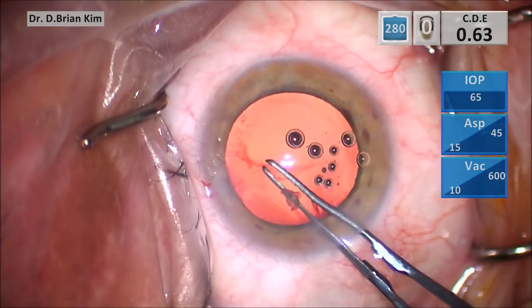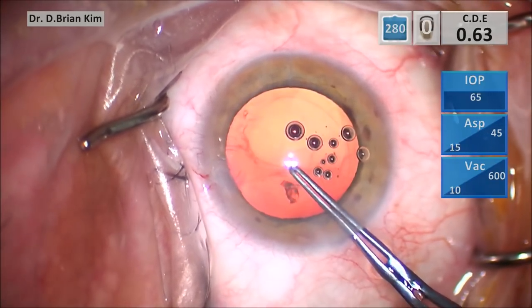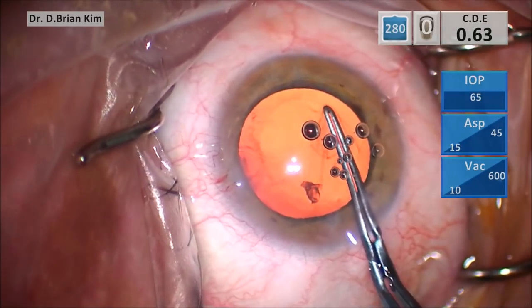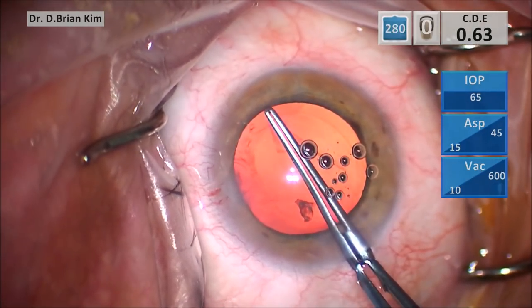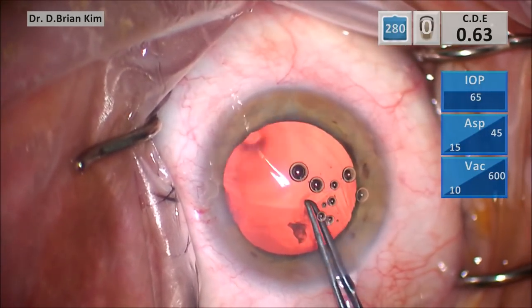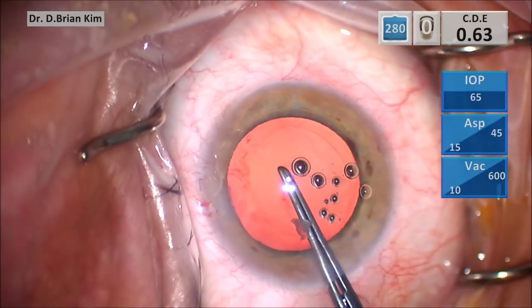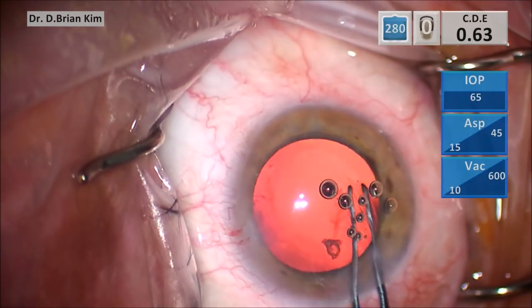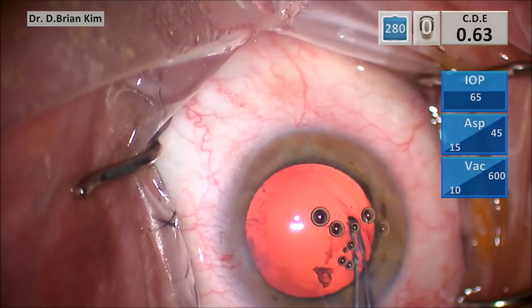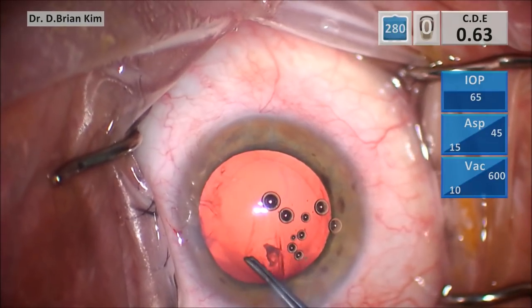So I'm finding the edge of the posterior capsule tear here. And it's very thin, much thinner than the anterior capsule. But as you can see here, I'm able to pull it, and I'm actually propagating it. And now it's on the right side at about the 2 o'clock position. And again, trying to find that edge so I can complete the posterior capsulorhexis. And so there you go. So I finished the posterior capsulorhexis.